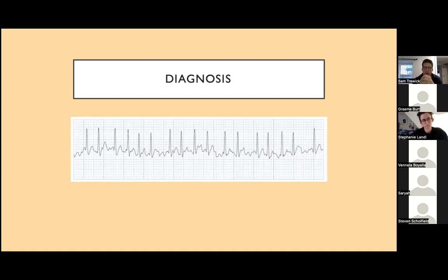So I've alluded to the diagnosis. To detect this, the way that we do that is with an ECG. But what happens if somebody says, I had palpitations, I've come to A&E, there's a 10-hour wait in A&E, and now that I'm seen, I've got no palpitations? If we do an ECG at that point and they're in sinus rhythm, do we say, fine, this is not AF, we're happy, we've done the job? What do you do in that situation? How can we diagnose AF then?